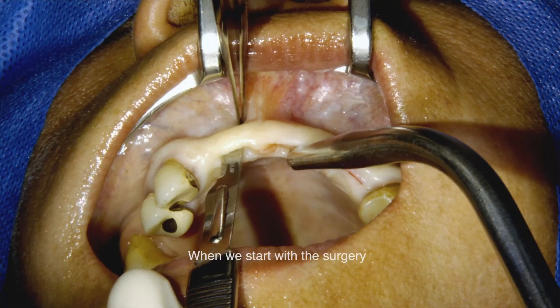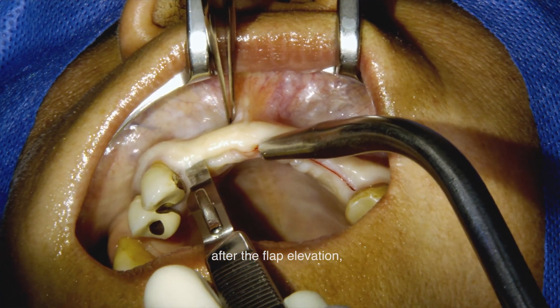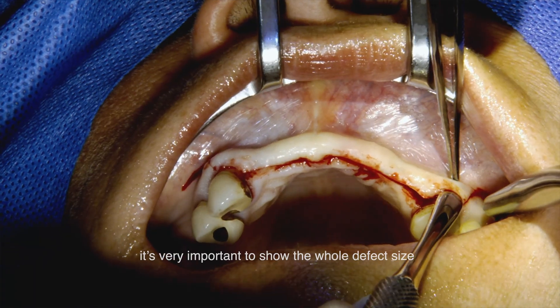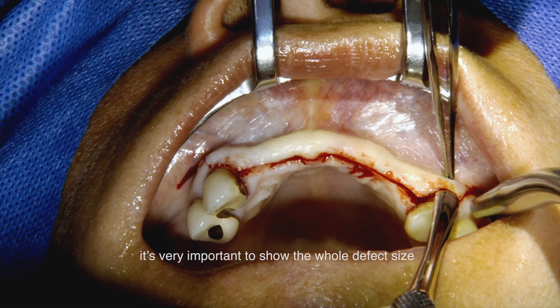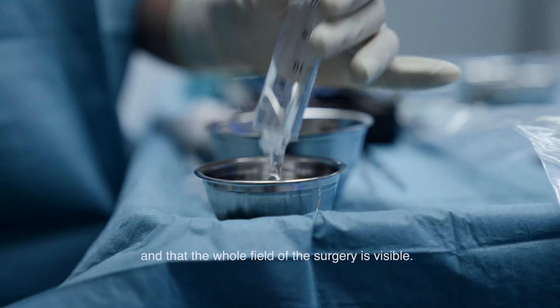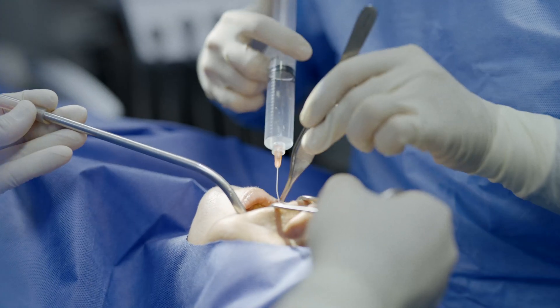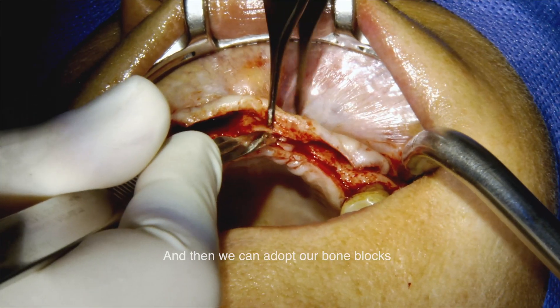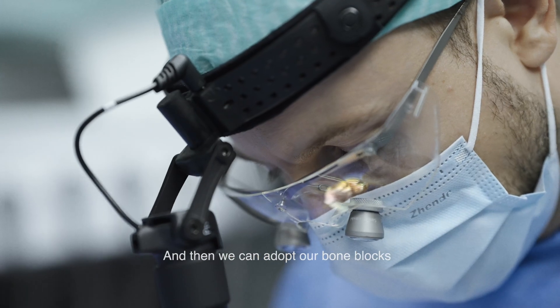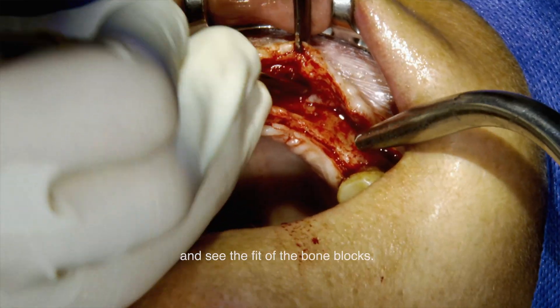When we start the surgery, after flap elevation, it is very important to expose the whole defect so that the entire surgical field is visible. We can then adapt our bone blocks and assess their fit.